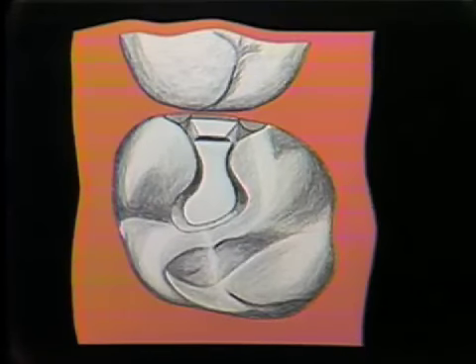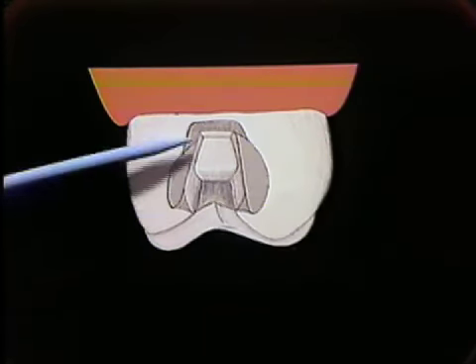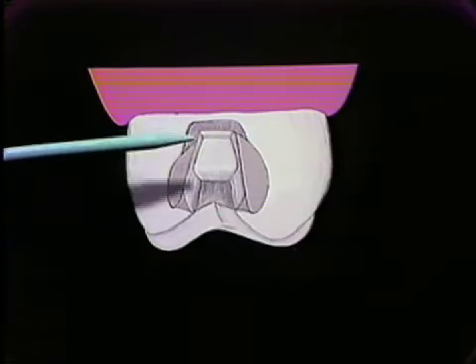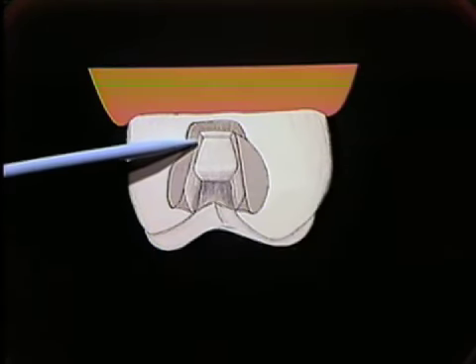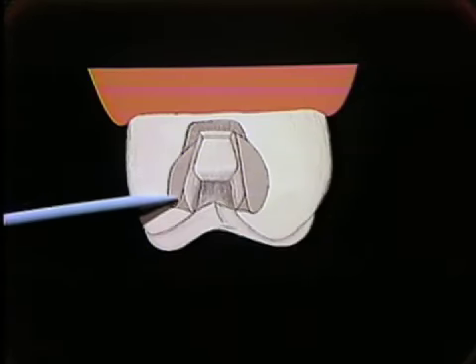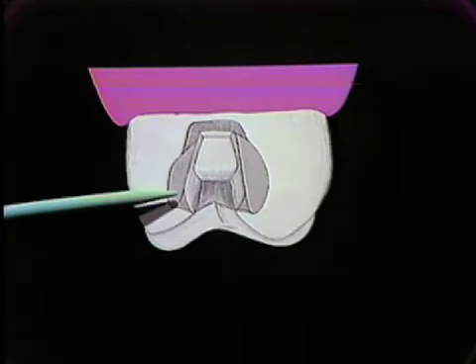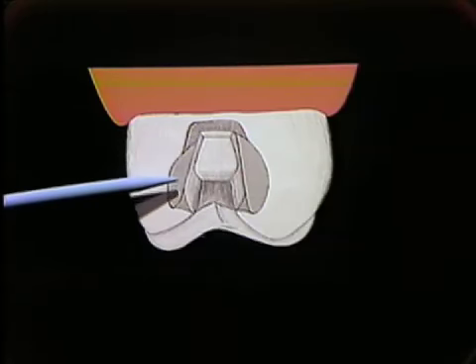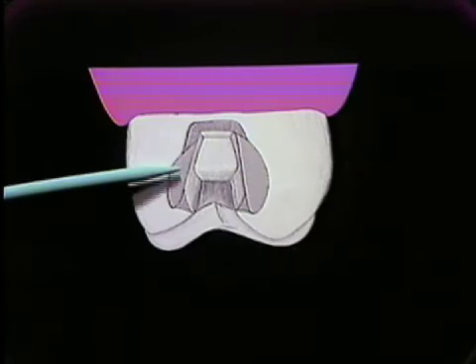From the proximal viewpoint of this, you will notice that the slices are of different lengths from cervical to occlusal. If you will note on the lingual, the corner of the cervical floor has been covered with a slice all the way to the occlusal. On the buccal side of this tooth, you will note that it comes maybe just 2/3 of the way to the cervical, but all the way to the occlusal. This indicates that these slices have been placed individually. We will show this again later as we demonstrate this technique.